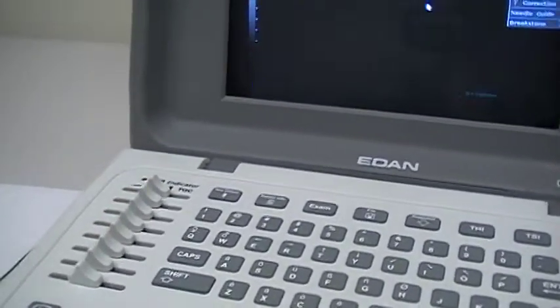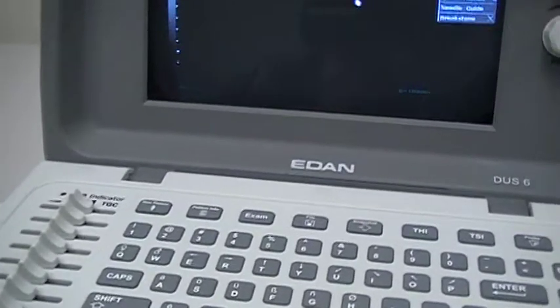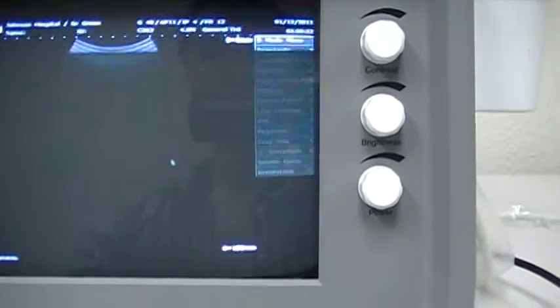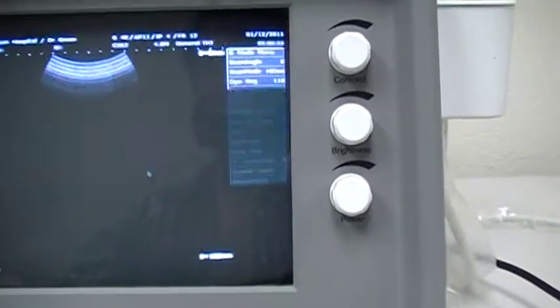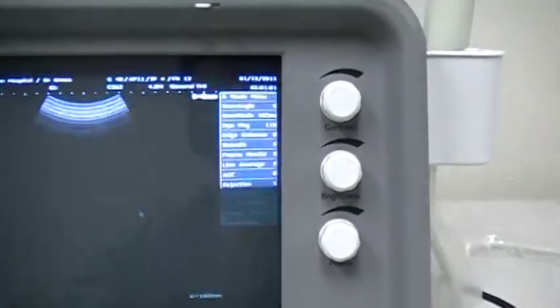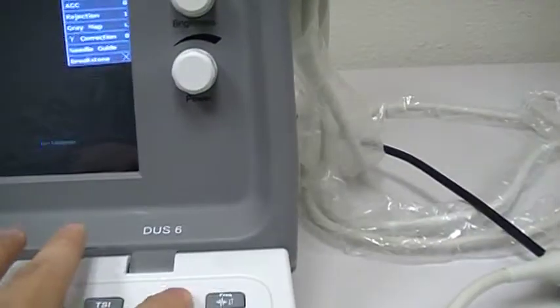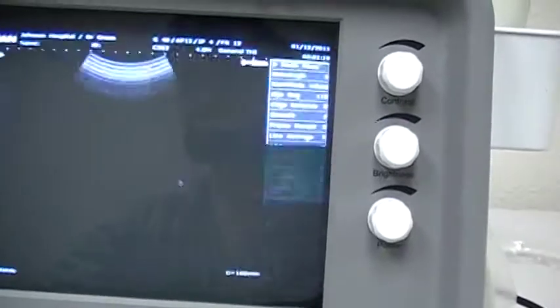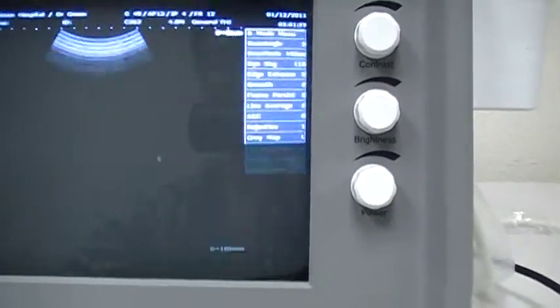During the installation we set this machine to obstetrics exam as the default, so it is currently in the obstetrics exam mode. You can change the probe type here if you want — for example, change it to the transvaginal probe if needed.